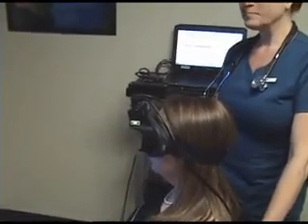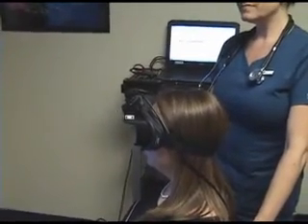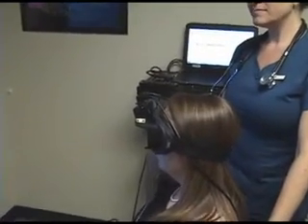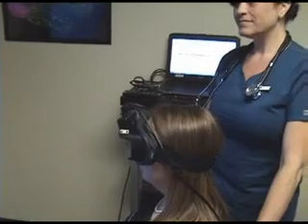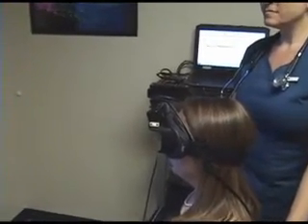And some of you may have been to your ENT and have had something called a caloric. A caloric is when they put warm or cold air into your ear, and that can create vertigo and things of that nature. I want you to rest assured that in our office we don't use that unless we really believe that there's an inner ear problem. So typically we just use the neurological components for the VNG.